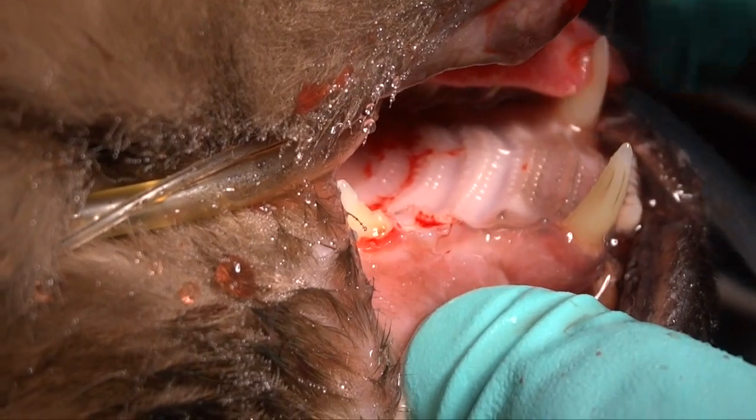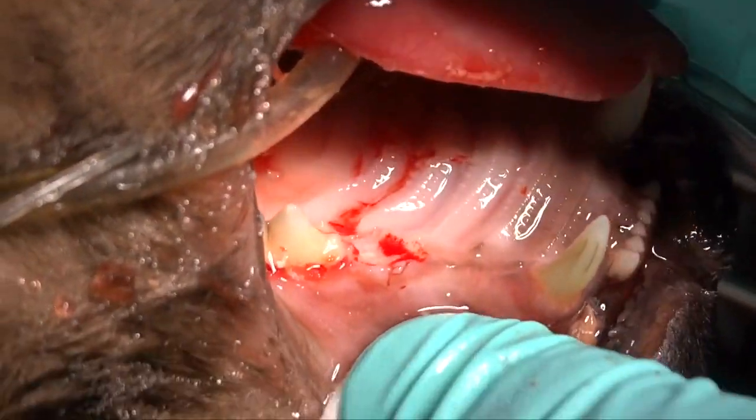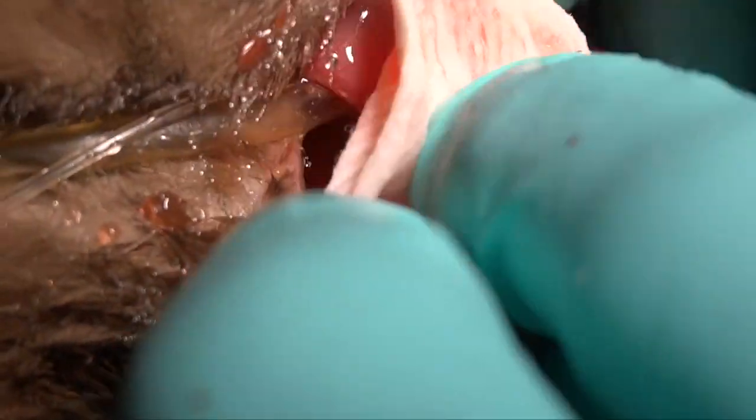You can visualize that as you're going, then confirm radiographically, and you're ready to suture.